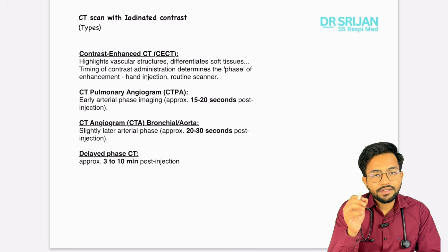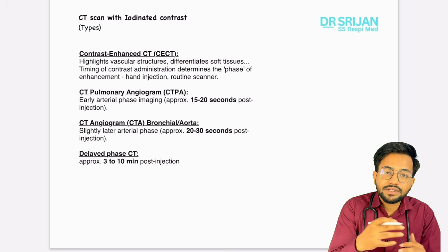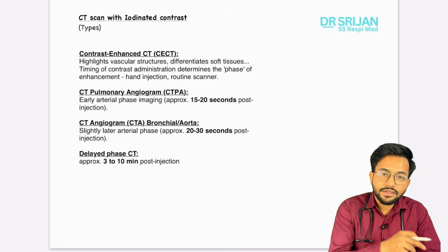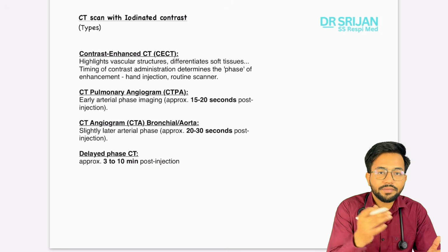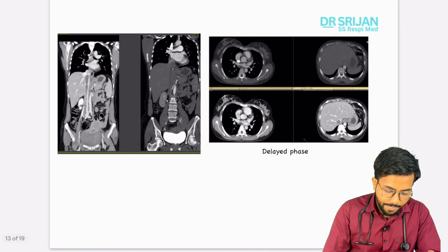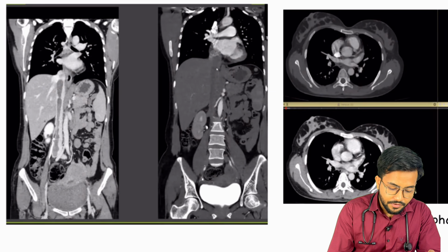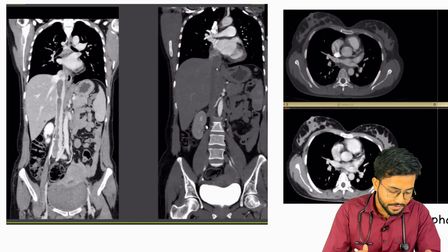So basically the crux of the story is we have a pressure injector and all the timings and protocols are set. You just push a dye and you take some pictures. Depending upon which stage the pictures are taken, the nomenclatures are different. Let us proceed. I want to show you some clinical importance of taking some contrast pictures.